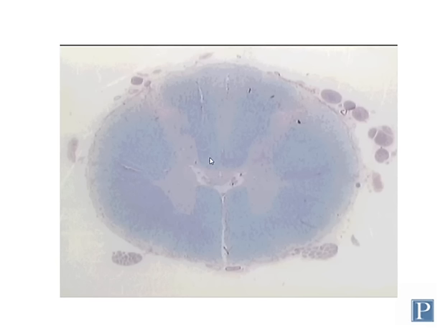This is a cross-section through the spinal cord, somewhere around the thoracic level, probably, and this is a magnified view of the spinal cord here. Again, this is stained with that fast blue stain, which is going to stain the white matter a kind of bluish purple color, and the gray matter is a lighter, more eosinophilic color. So note that the distribution of white and gray matter in the spinal cord is approximately inverted relative to the brain, including the cerebrum and the cerebellum.